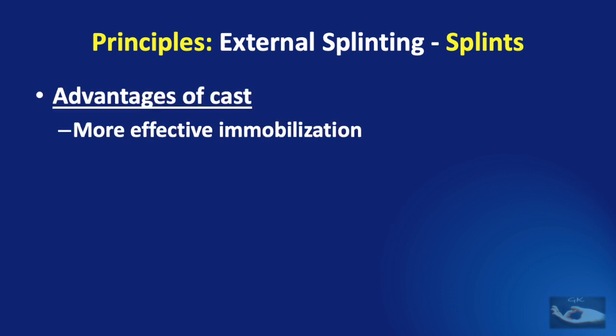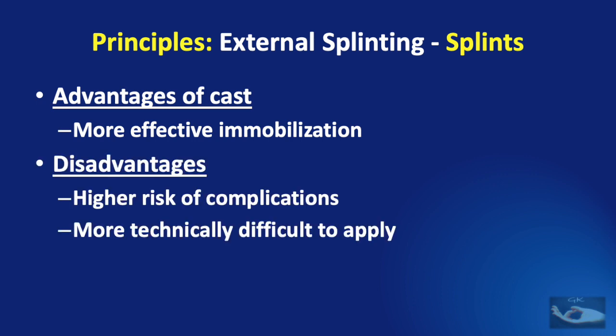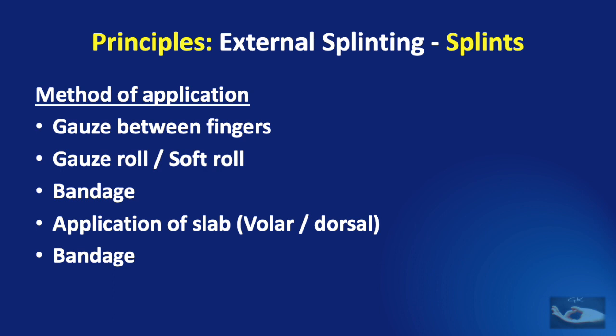The advantage of cast application is more effective immobilization, but the disadvantages are a higher risk of complications and that it is a little more technically difficult to apply. Application of this splint consists of 5 steps.